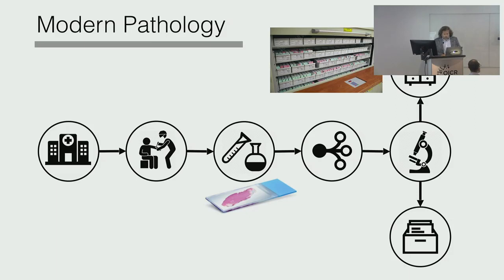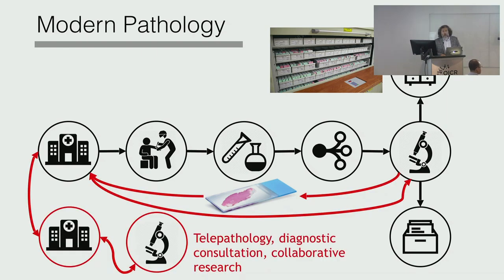And it gets really complicated. I'll show you an image that shows the actual complexity. It gets complicated if pathologists are working on rare cases. Suddenly you have to add an additional layer of complexity: if I don't know what is on the glass slide, I have to send it back to the hospital. The hospital sends it to another hospital. Another hospital sends it to another pathologist.